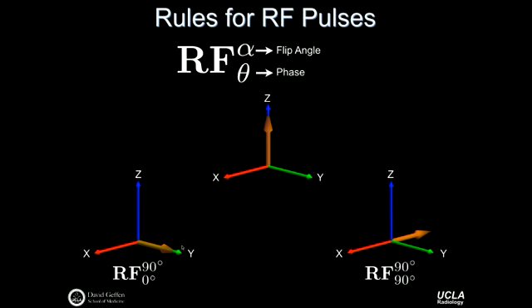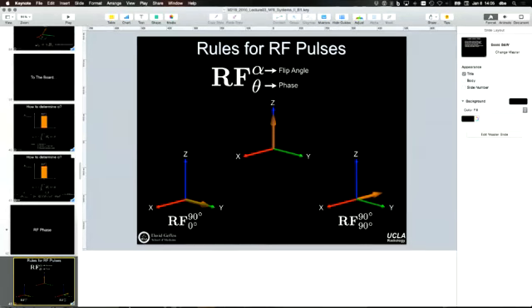What axis does my thumb point down? Minus x. And where does my bulk magnetization end up if it's a 90? Minus y. Right? So you can work through those different examples. Those cases are easier, of course, because if you look at that transformation matrix, did I take the slide out?